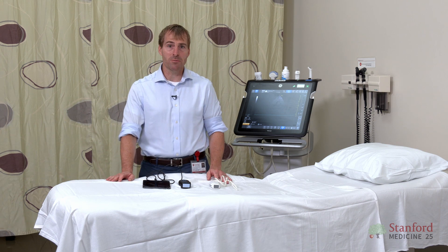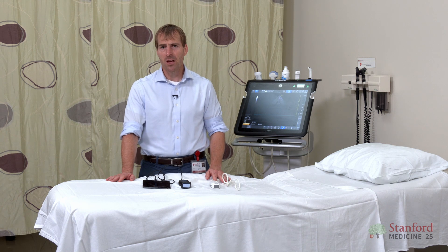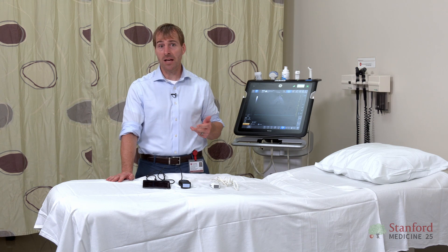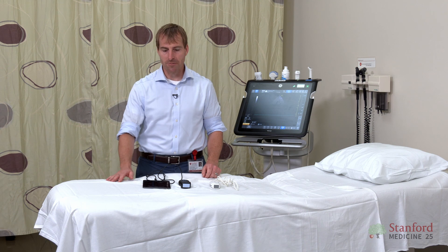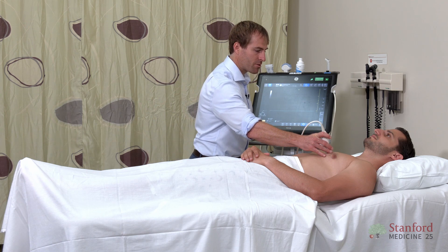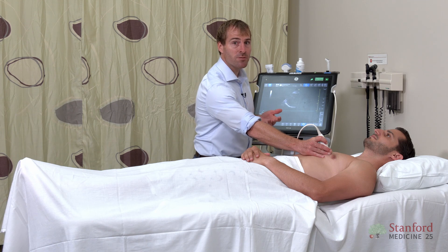Now, once you have a machine, you need to make sure you know how to use a few basic functions. I want to make sure that we review the functions that every ultrasonographer should know — anyone who's doing point-of-care ultrasound. You really need to know how to adjust the depth, how to adjust the gain, how to freeze, take a measurement, and then record a short video. Let's go ahead and get started — I'm going to grab an image here just so we have something to look at.